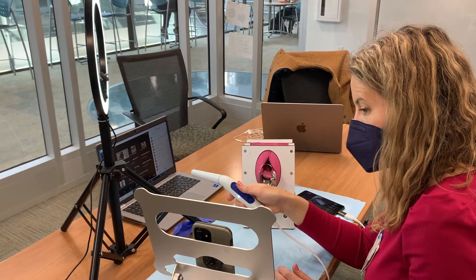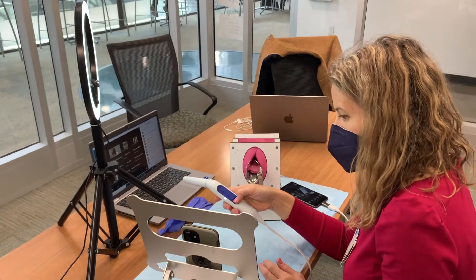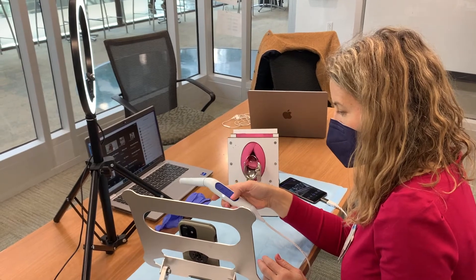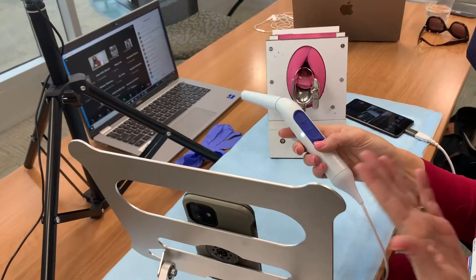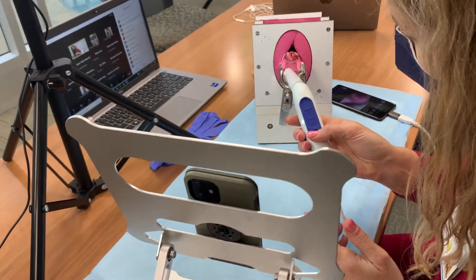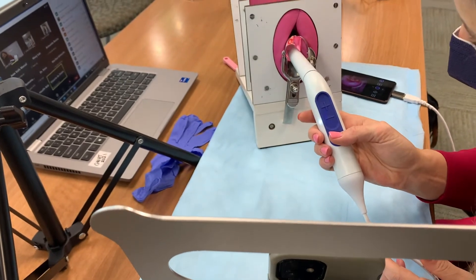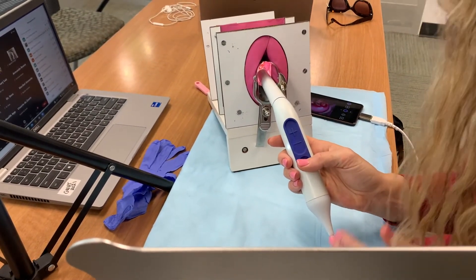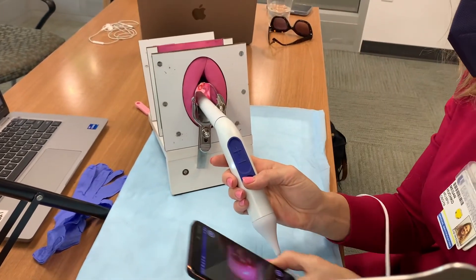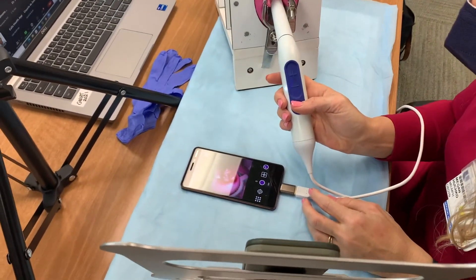On both screens you can see the light button and the zoom feature. This is how it's used inside the cervix — the speculum is placed, and I use this as my light source and enter it into the speculum. I'm using a camera here so I can visualize the focus and details on the camera.